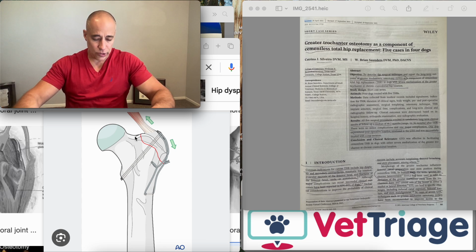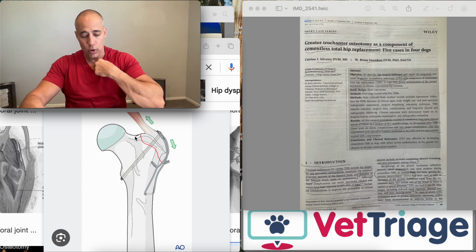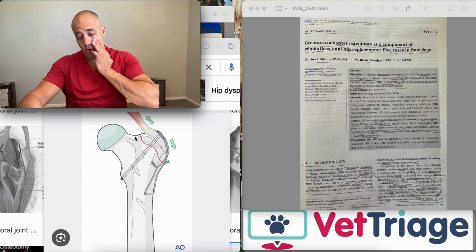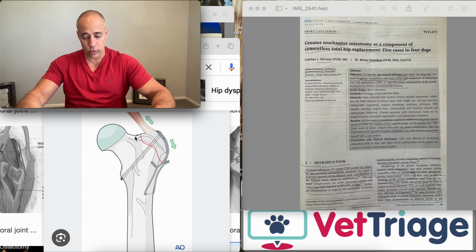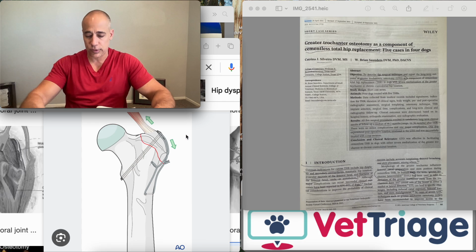Okay, radiographic evaluation. On post-op radiographs, acetabular size of the cup, angle of lateral opening, degree of retroversion, and inclination angle were determined. In the frontal plane, a positive stem position value denoted varus angulation, whereas a negative value denoted valgus angulation. In the sagittal plane, a positive value denoted a craniocaudally tipped stem, whereas a negative value denoted a caudocranially tipped stem. And then they assessed stability of the pin and tension band wire, which is what this is here. Pin and tension band. Tension band because the forces here are pulling down on the greater trochanter, opposing the forces from the gluteal muscles in the opposite direction.